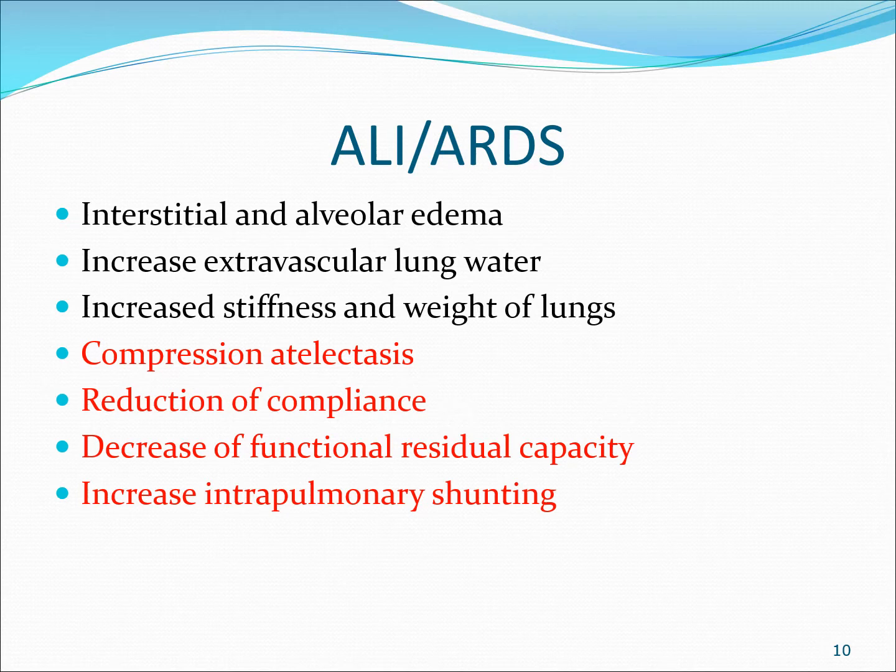All ventilators have compliance readings, and you want to trend that. You want to see how it's getting worse day by day, and then you want to do some kind of intervention. Also, you'll see a decrease in functional residual capacity, which will impact oxygenation, and you're also going to see an increase in intrapulmonary shunting, which again compromises oxygenation status.